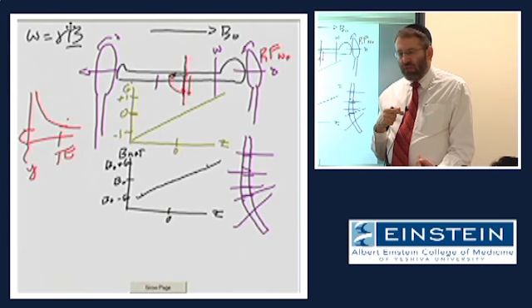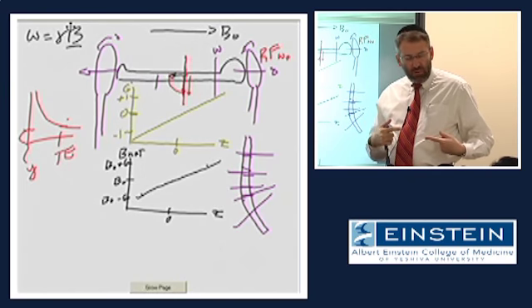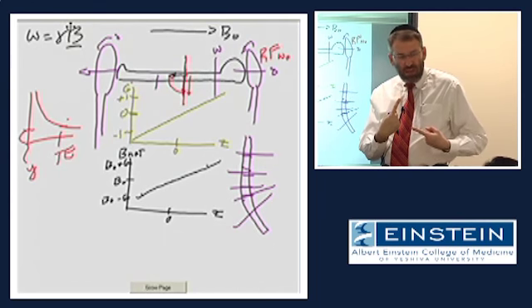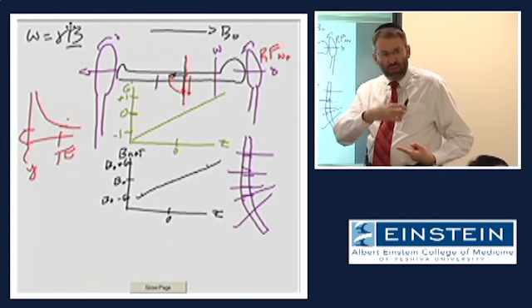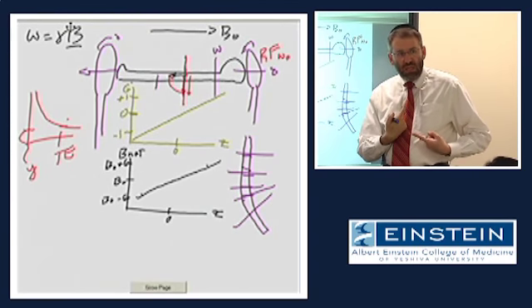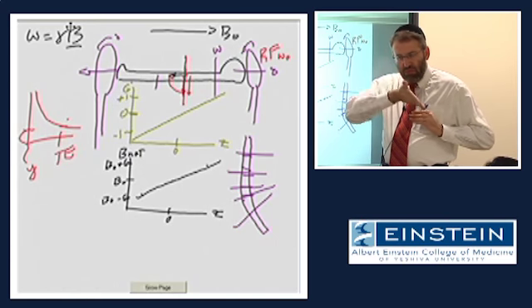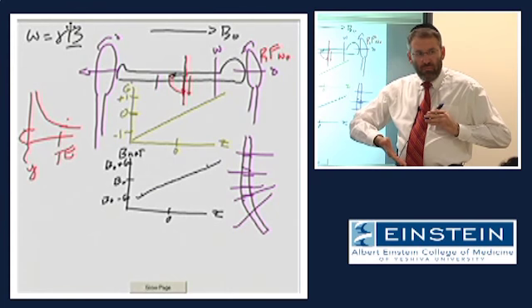Okay? So if I turn on my z and my x gradient magnetic fields, those are magnetic fields, they're vectors. And those vectors can be summed together to give me some net oblique gradient magnetic field. And with the x and z gradients on, I'll have some oblique that will give me slices that are cutting through on a diagonal. So if you change the relative magnitude of those, you can do... Exactly.